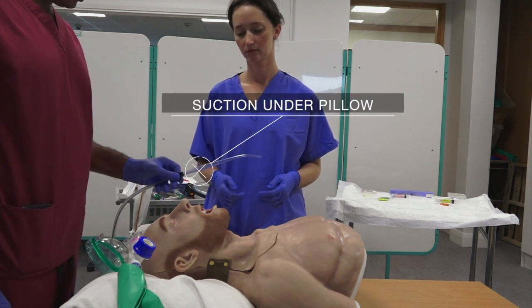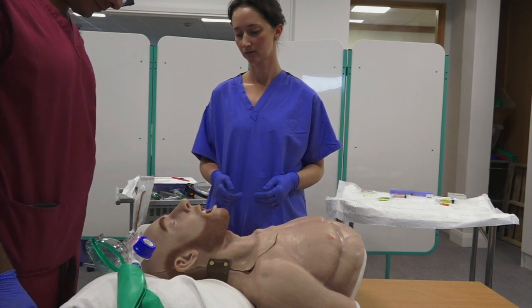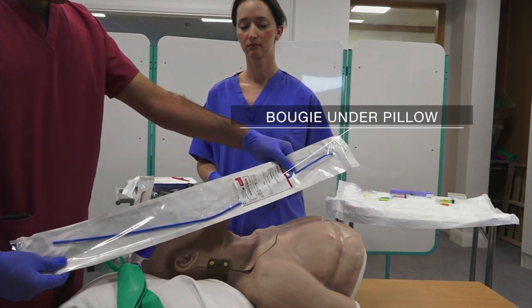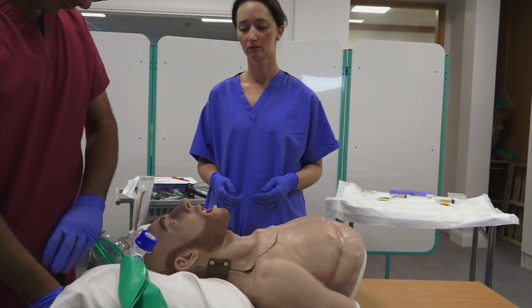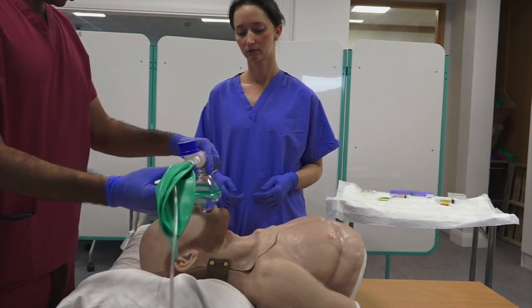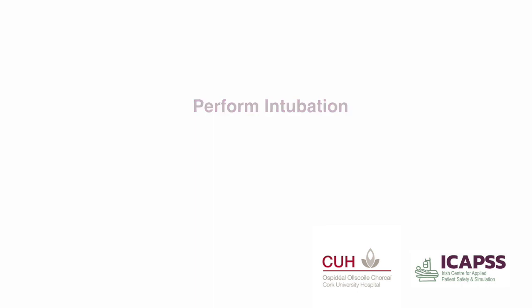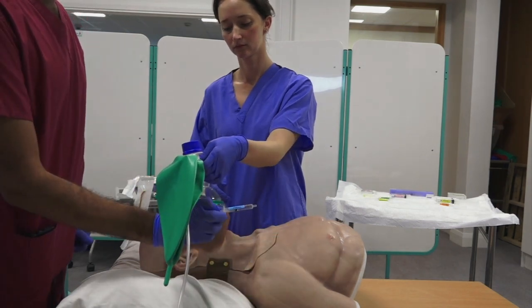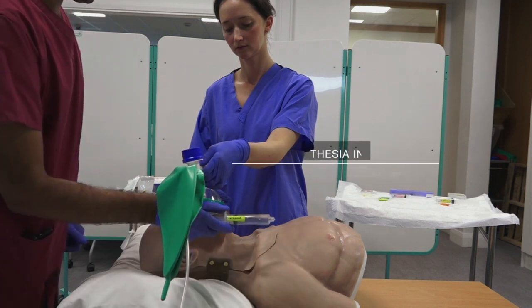Ensure the Yankauer suction is turned on, connected, and placed underneath the pillow. Ensure a bougie is available and placed underneath the pillow. Note that during the filming of this demonstration, wall oxygen was not available, so ventilation bags will not inflate as in a real-life scenario.